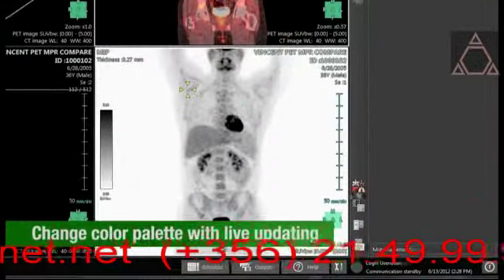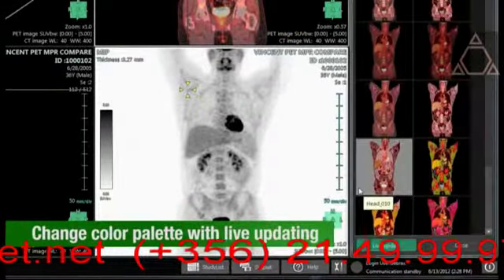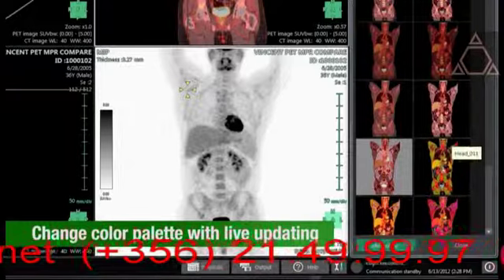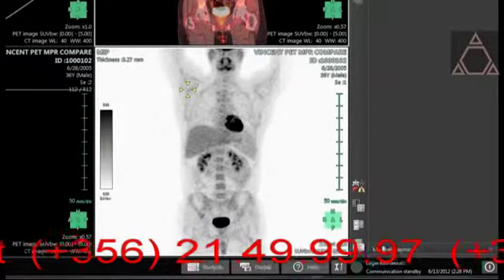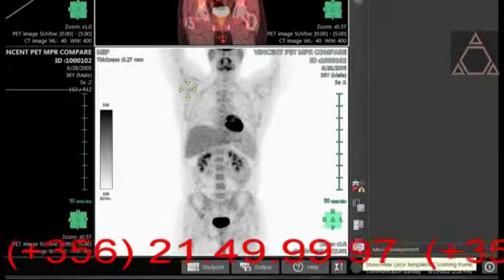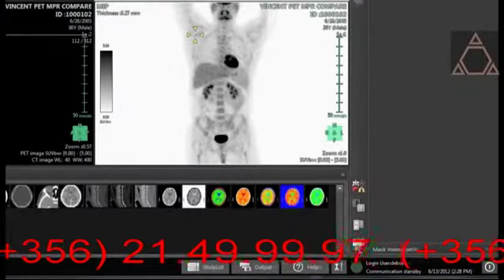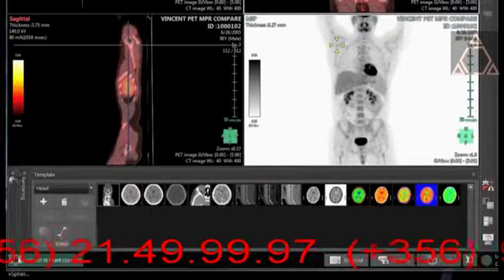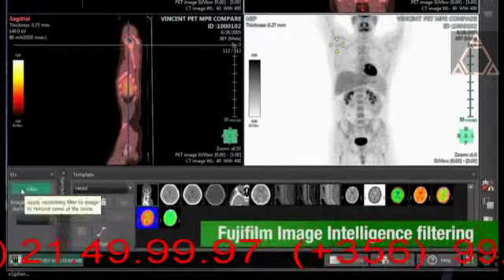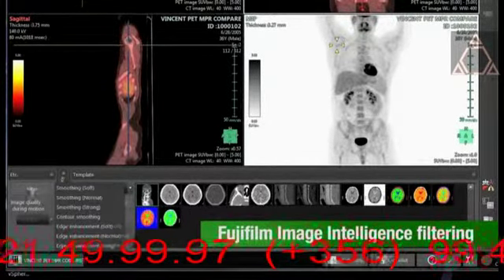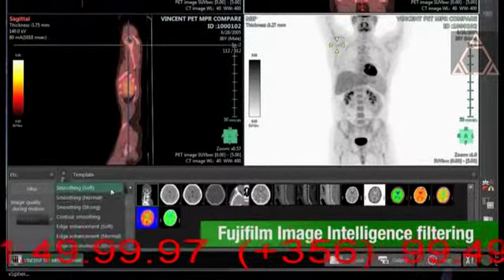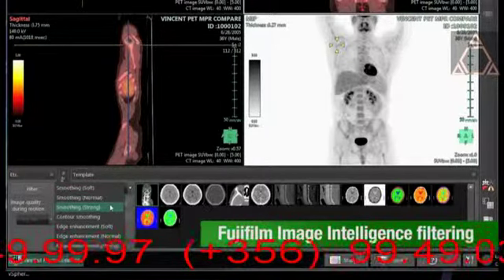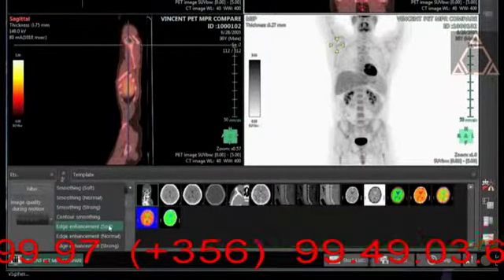Choose from several color palettes with live updating. Synapse 3D includes Fujifilm's proprietary image intelligence filtering options that can help clarify images that are grainy or hard to see.